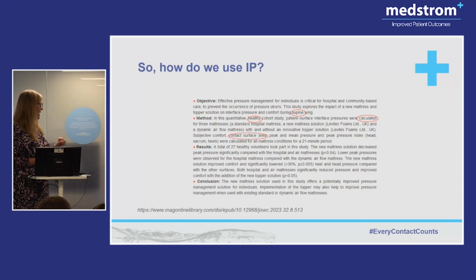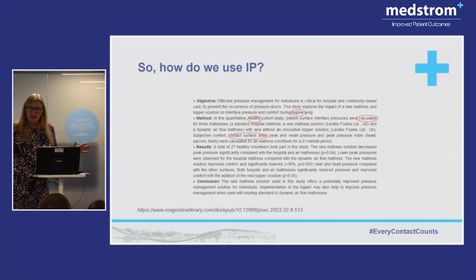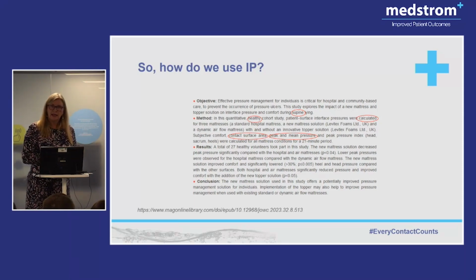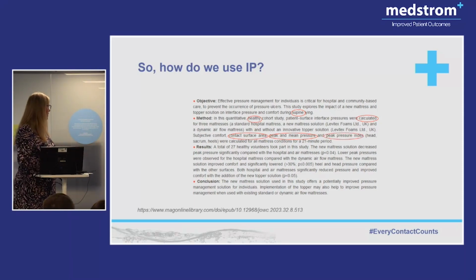We looked at contact surface area. So how big was that? How much of the patient was it? And peak and mean pressures, two different things. Understand the difference. This patient sat on one IT. This is the average across the whole of them.